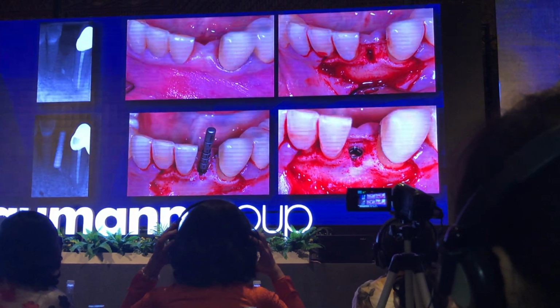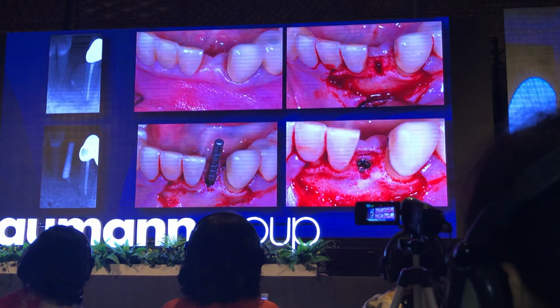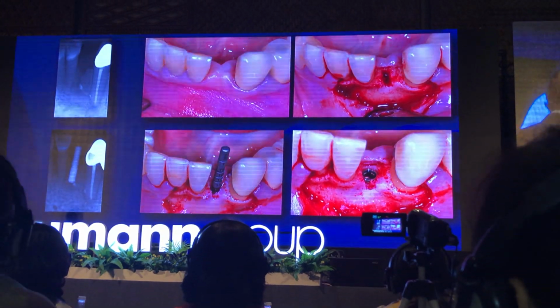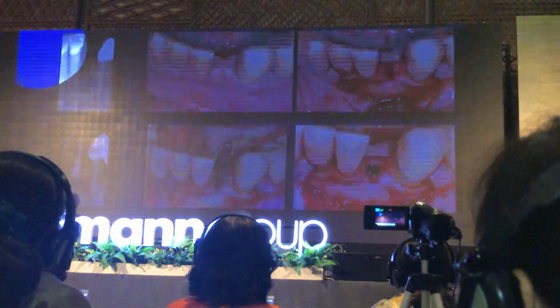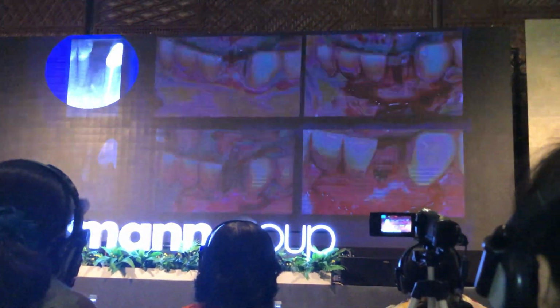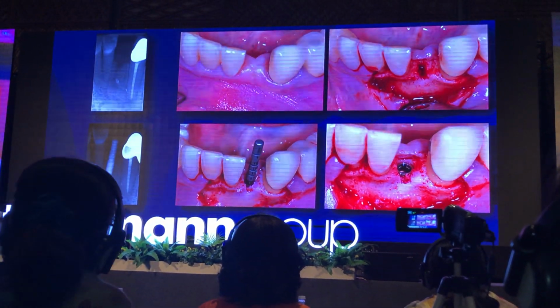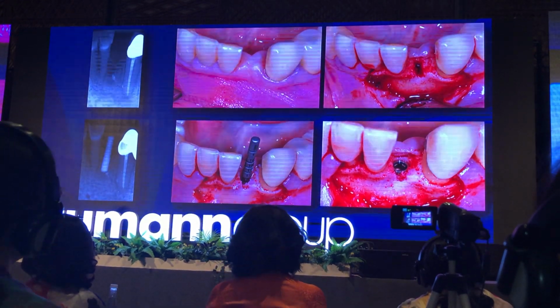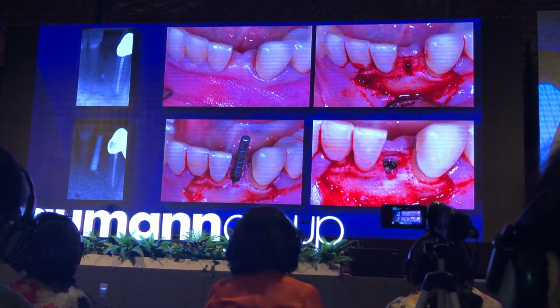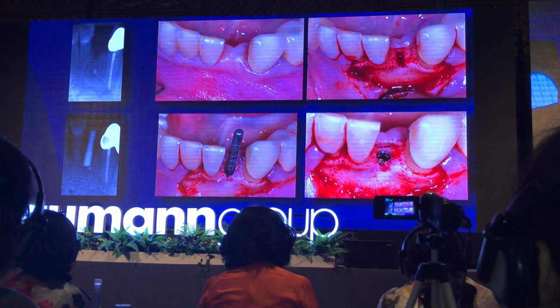Okay, this is the case I showed you yesterday, just that it is the BLT 2.9 millimeter. BLT 2.9. And you see the patient was referred to us with a single tooth situation here for the lateral incisor. And when you measure this, this is less than 7 millimeters, probably 5.5 to 6 millimeters mesiodistal space. So you've got to be very careful. You cannot use a standard diameter implant. Even an NNC implant is a little bit much.